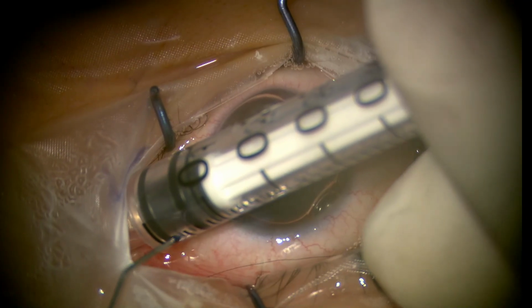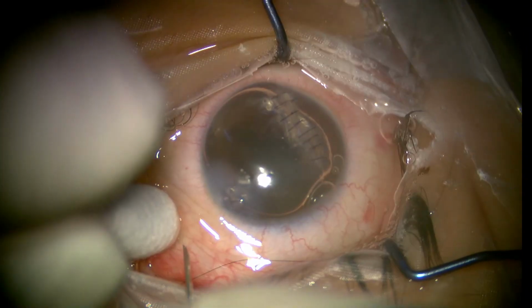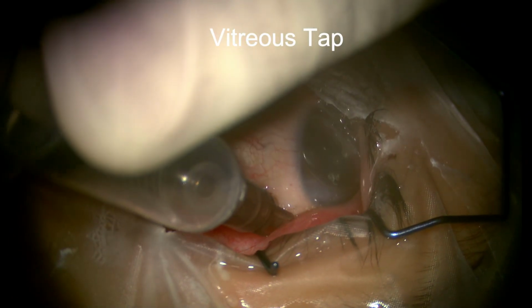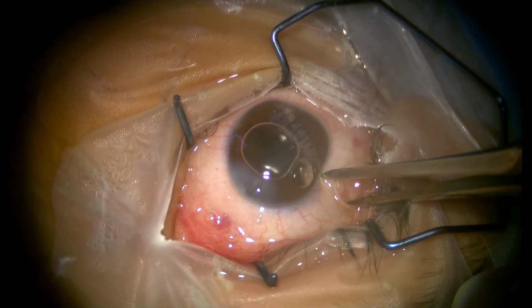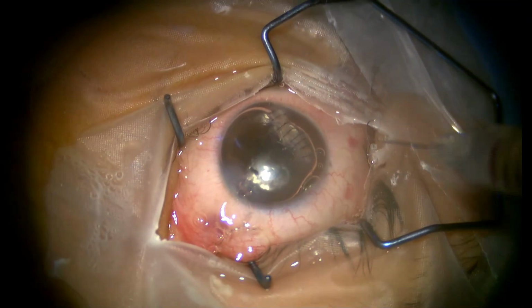Then, using trypan blue dye, 4 mm distance from limbus is marked in view of vitreous tap for gram staining, bacterial culture and KOH mount, but the result was found negative for all of the three. Calipers measure 4 mm distance from the limbus.